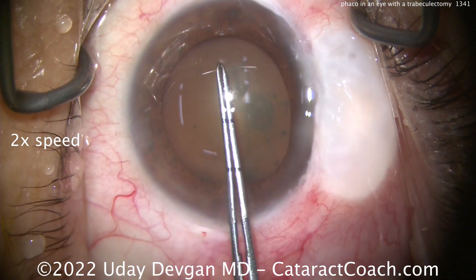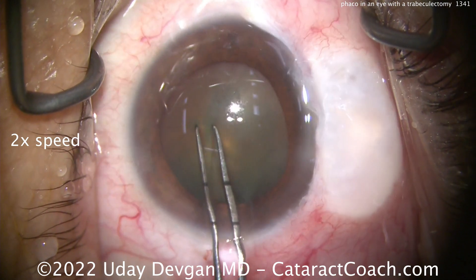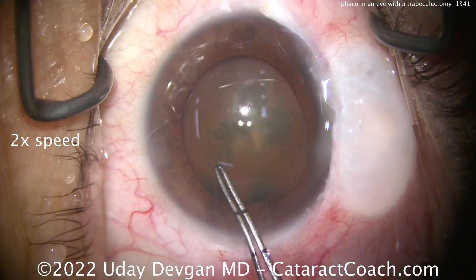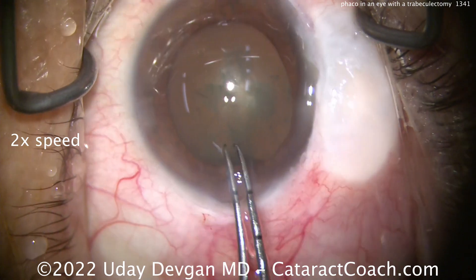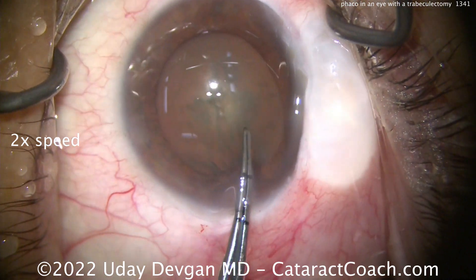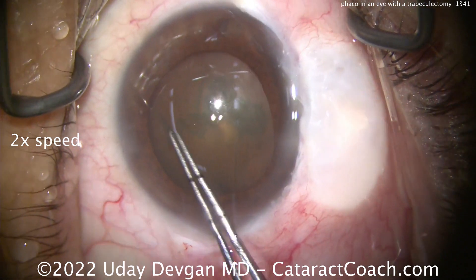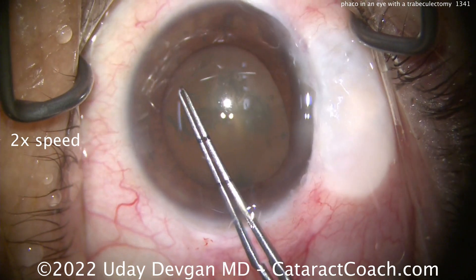Here we're zooming in. The glaucoma doctor said, 'Do me a favor — I do not want a big rhexis.' He wants a small rhexis because he wants to make sure that even if this patient overfilters or gets hypotony in the post-op period, he wants the IOL to stay in the capsular bag. So we're aiming for about a 4.5 mm rhexis here.